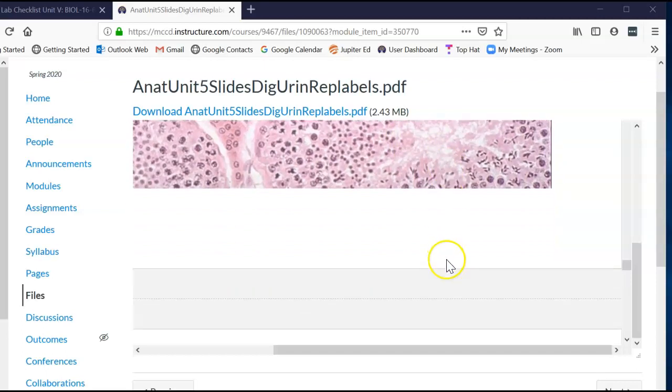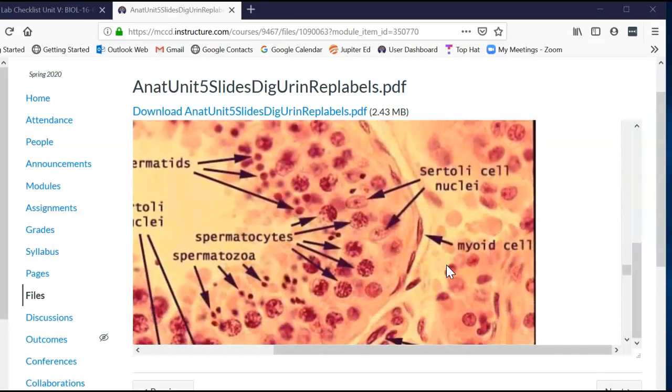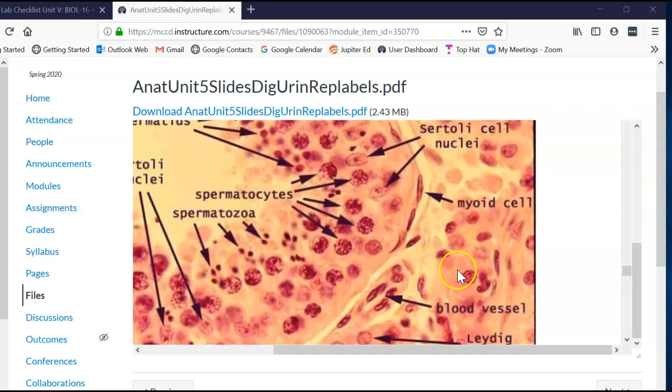epididymis. So I'm going to go down a slide here. These are sort of named for us. And here's our seminiferous tubule. Here's the lumen of the tubule. And the tubule consists of these huge cells that support, their cytoplasm, or the cell membrane of those cells, wraps around each of these developing spermatocytes. And those cells are called Sertoli, or nurse cells, Sertoli cells. And so you can see the nuclei of this particular Sertoli cell.